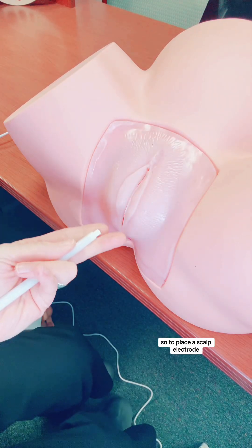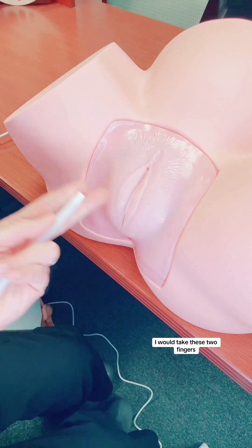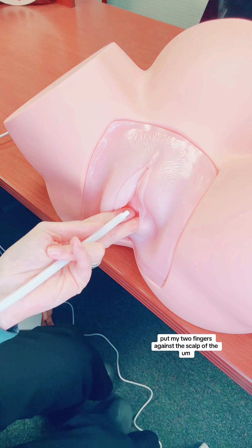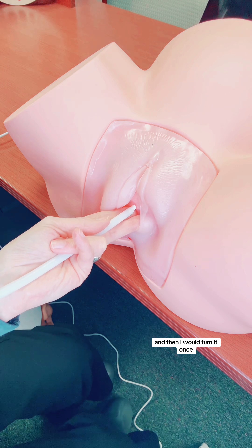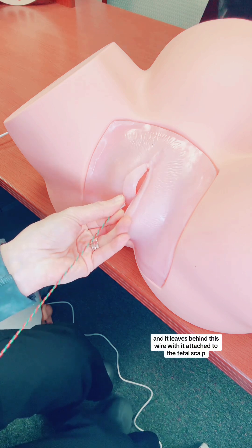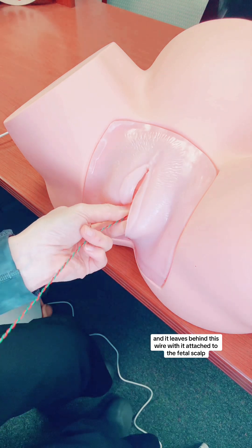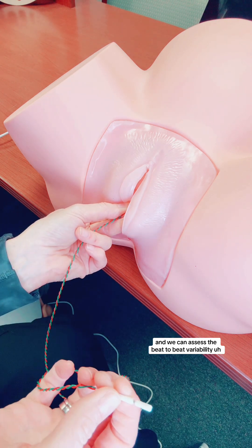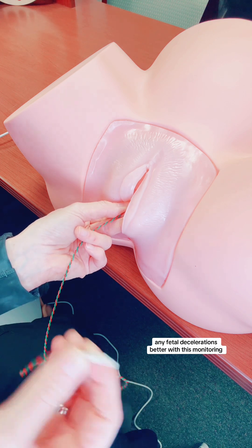To place a scalp electrode, I would put my fingers inside the labia. I would take two fingers and you can see the scalp right there — the fetal head. I would go in, put my two fingers against the scalp of the fetal head, place this up against it, and then turn it once, twice, and then this sheath comes off and it leaves behind this wire attached to the fetal scalp. This wire then attaches to the electronic monitor and we can assess the beat-to-beat variability and any fetal decelerations better with this monitoring.